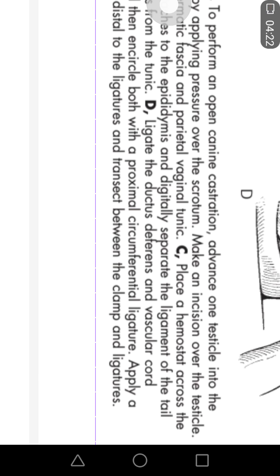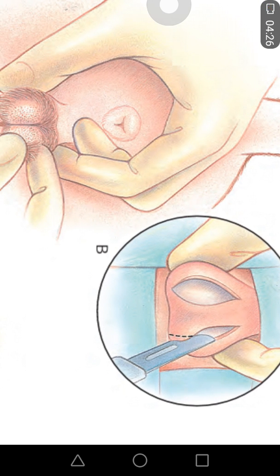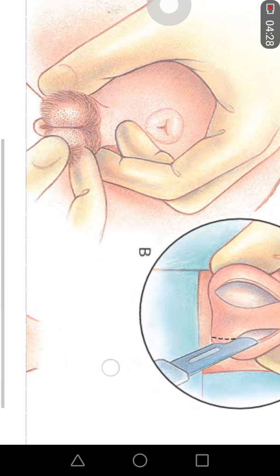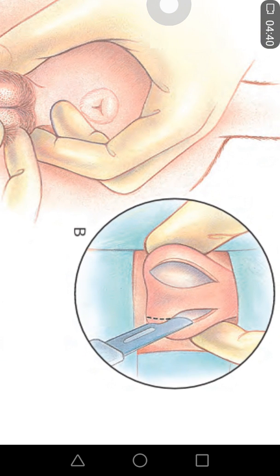For feline castration, the difference in pre-surgical preparation is that the hair of the scrotum is plucked out completely and the area is prepared aseptically. For feline castration, the scrotal approach is used, and the incision is given at the respective testis.